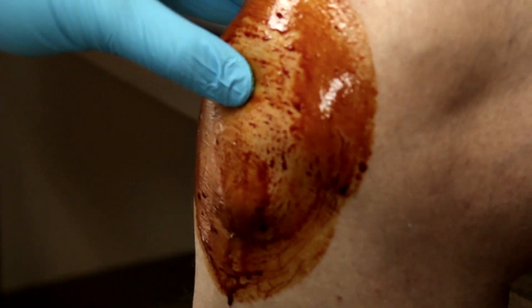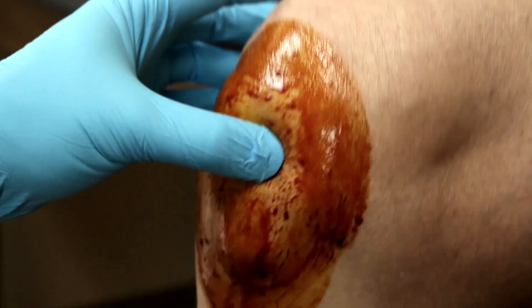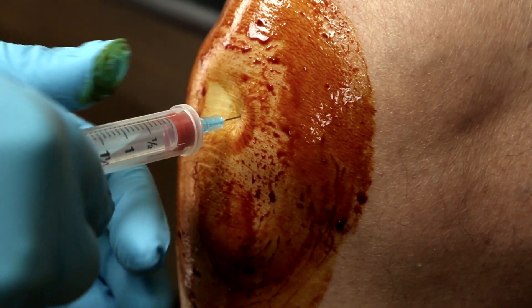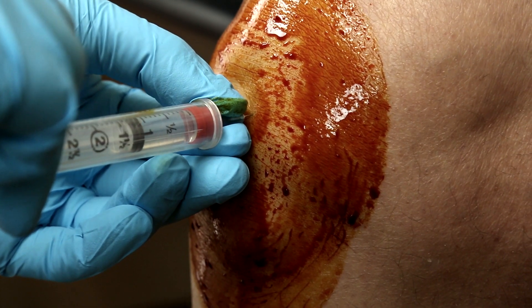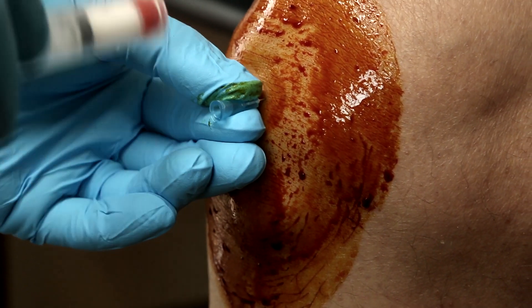There it is — you can see it. Finding my place next to the patellar tendon, underneath the patella, going into the knee joint. How are you feeling? Barely. Okay. So I'm putting in a lot of anesthetic. It goes in very easily because we're not in a tendon or somewhere we shouldn't be.